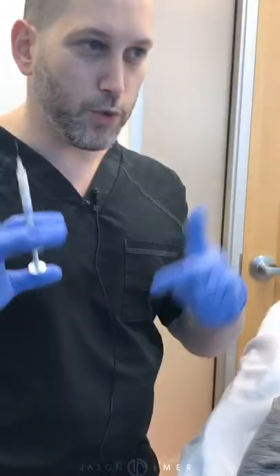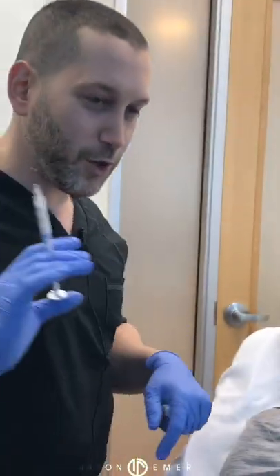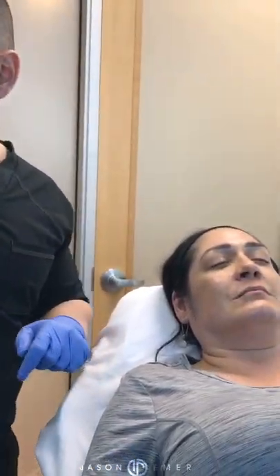So what we're going to do is we're going to use the fillers to lift the brow, sculpt out and define her lateral cheek, and just support around her mouth and give her a little lip plumping, because as you age, the area of the mouth starts to cave in. Same thing happens to the temple, which is why you get hollow there and the eyelids start to droop. So using volume, we can give some preventative lifting there, and we can enhance the signature features of her face.